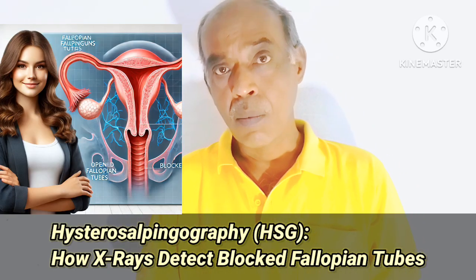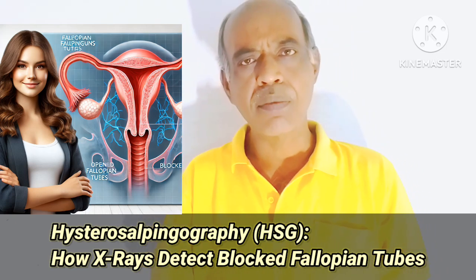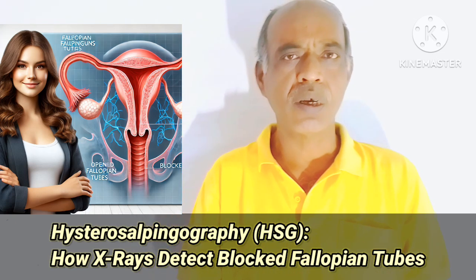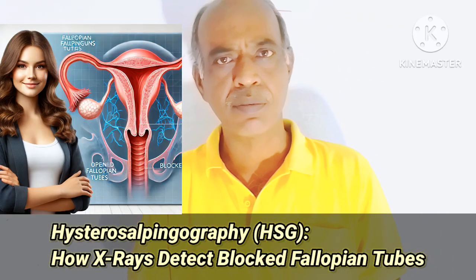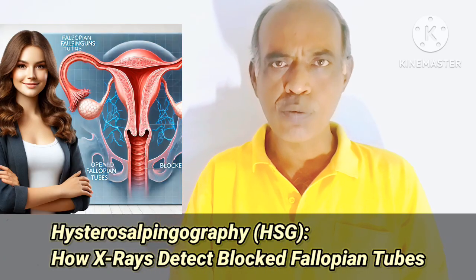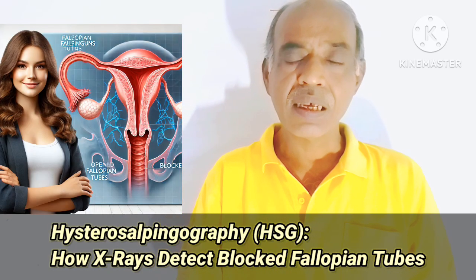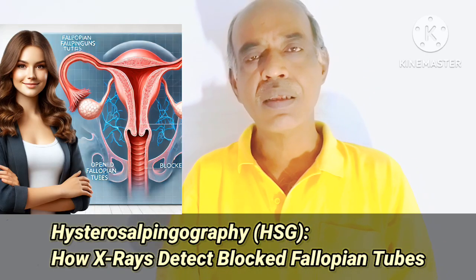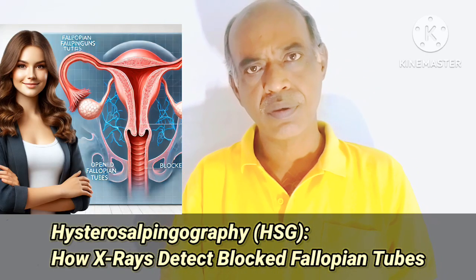hysterosalpingography. But there is still a problem. Sometimes the woman may suffer from involuntary muscle spasms in her fallopian tubes. If spasms occur, there is a chance of a false positive diagnosis.